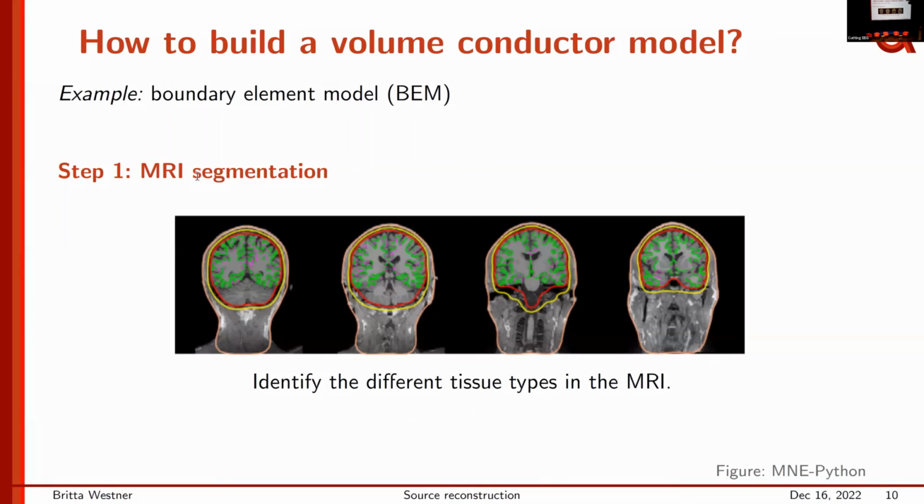She said, if I understood correctly, it is possible to compute the covariance matrix so that it allows estimating correlated sources. Is there a math demonstration for that? So it is not so much about estimating the covariance matrix, but about post hoc changing properties of your covariance matrix to make it invertible.